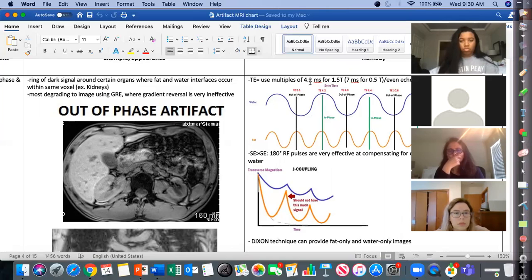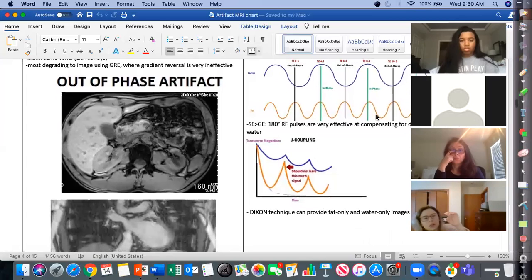And typically on the even echo, remember even echo rephasing from our last lecture, on the even echo, they're going to be in phase with each other at echo 2, at echo 4, at echo 6. Okay?